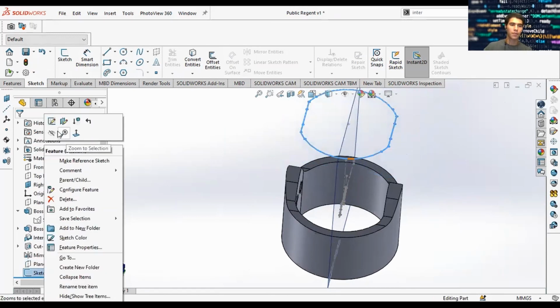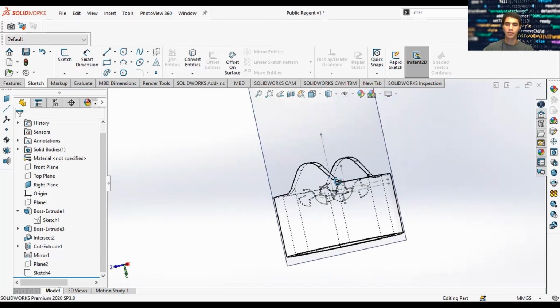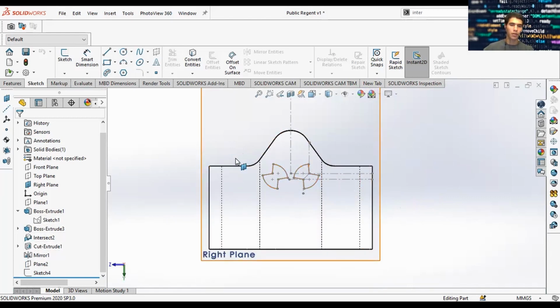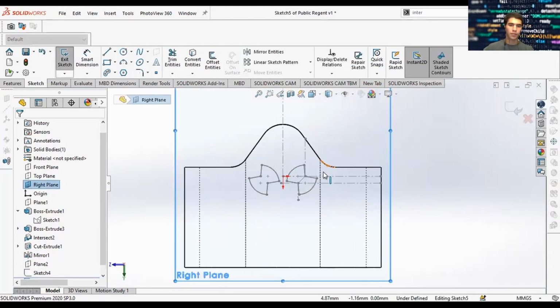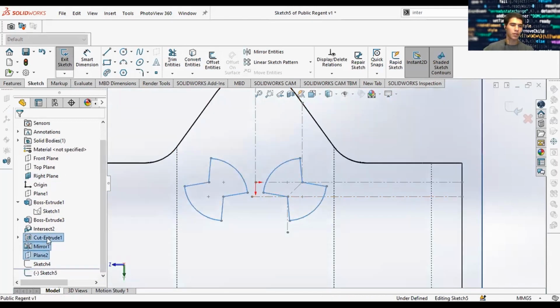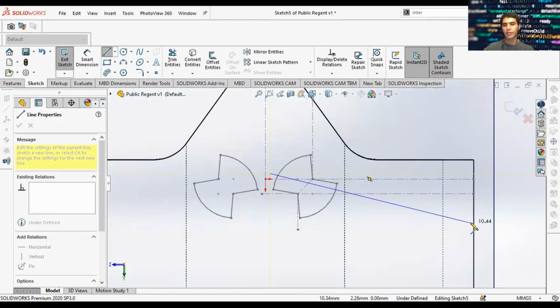And hide this sketch. And then we want to focus on the leaflets themselves. So we're going to hide our body, put it as wires with invisible lines. And we're going to sketch on our right plane. So we click our right plane and we click sketch. And we're not sketching over this sketch. We're sketching alongside it. All right. So here we go. We're going to draw our leaflet design.